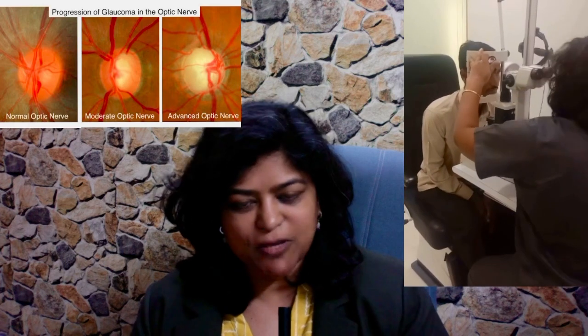Number two: a dilated fundus examination, or a fundoscopy. When we put drops and check the retina of a patient, we also see something called the optic nerve. The optic nerve has a typical cup disc ratio. The optic cup is in the center of this optic disc, and if this cup is so wide that the rim is hardly present in one of these areas of the optic disc, it is highly suspicious of glaucoma. So we look for something called excavation and notching at the disc margin. All these are suggestive of nerve fiber layer loss — this is what happens in glaucoma.